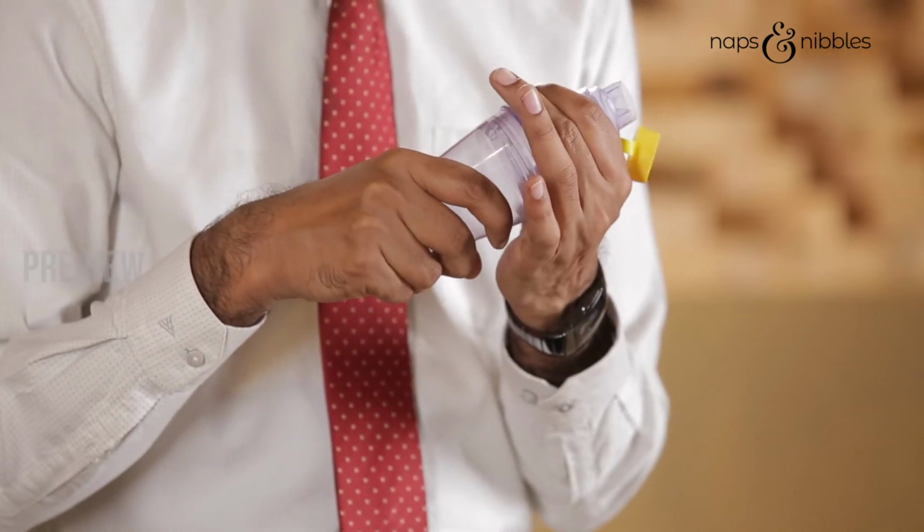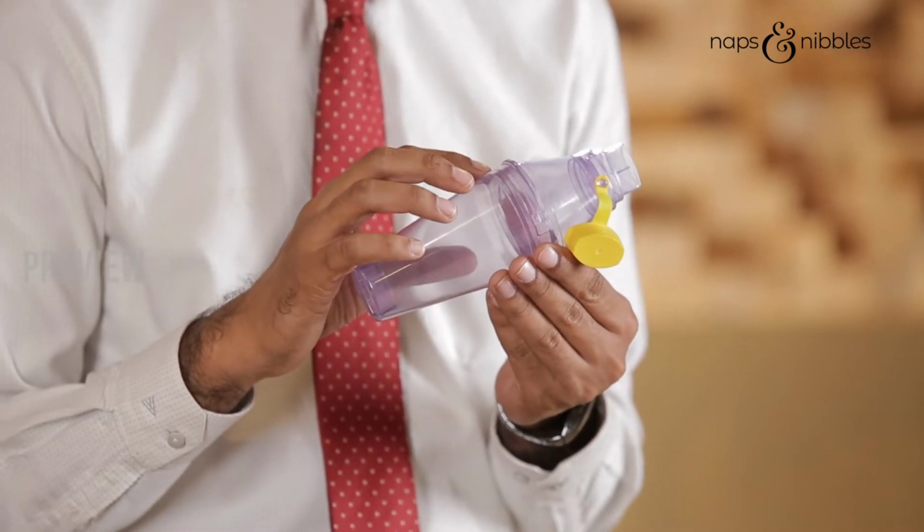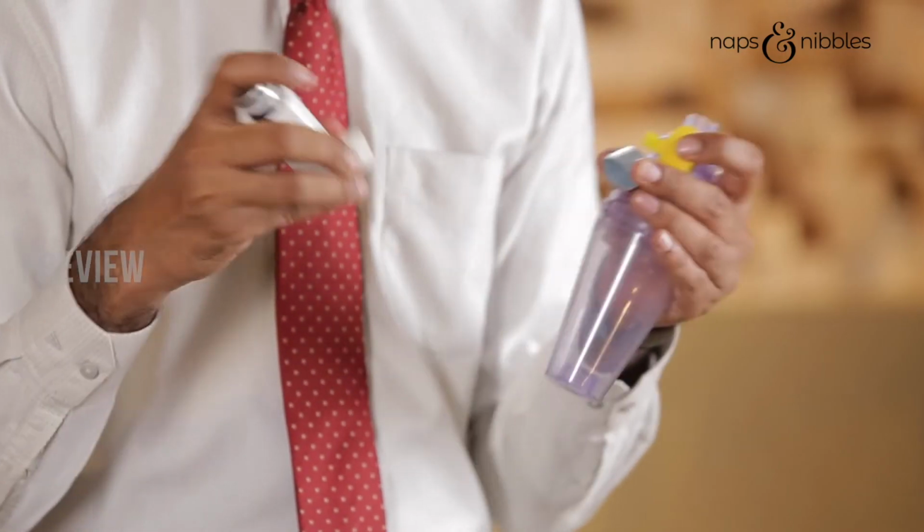The first step is to assemble the spacer. To do so, firmly push the two halves of the spacer together and rotate it with the mouthpiece cap in place. The spacer comes with two locks that ensure the proper assembling of both halves. You remove the mouthpiece cap from the mouthpiece of the spacer and then you remove the mouthpiece cap from the inhaler. You make sure that you shake the inhaler well.